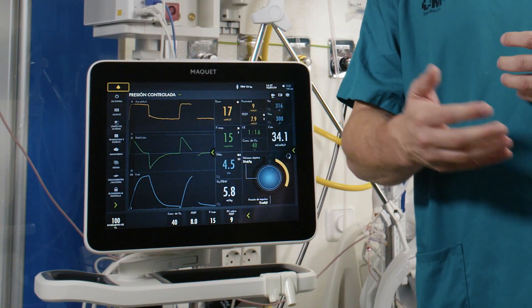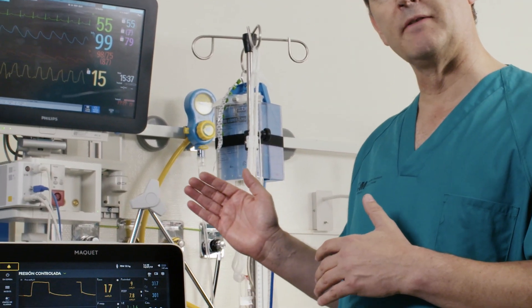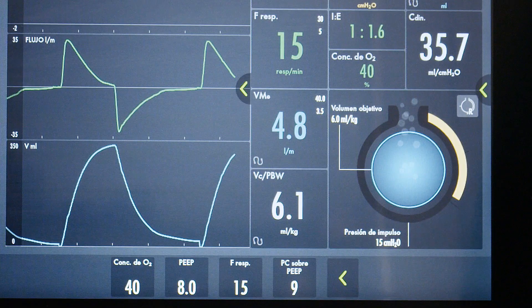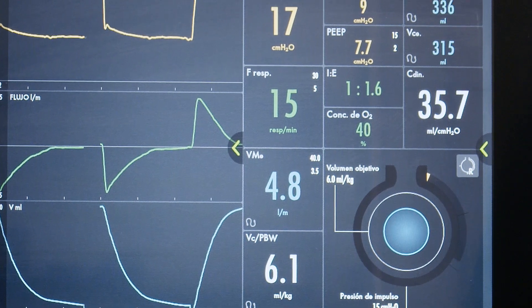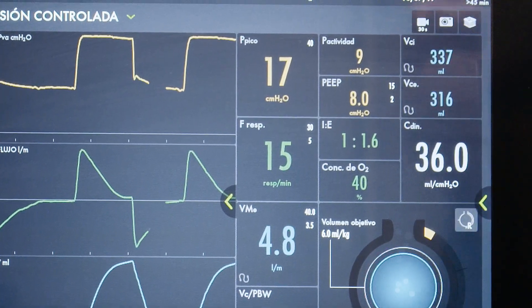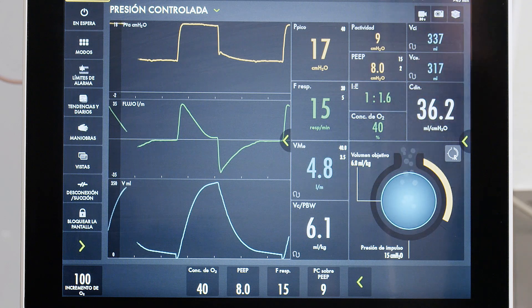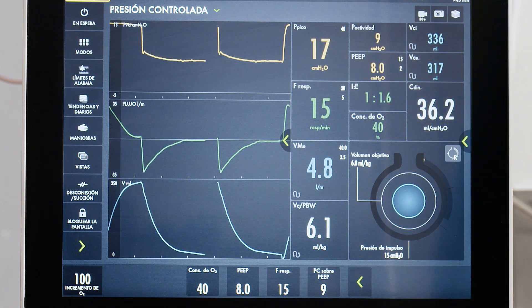Now the situation is 24 hours later. She has moderate respiratory failure due to an aspiration pneumonia. We are ventilating the patient with conventional lung-protective mechanical ventilation in a pressure control mode, with a PEEP level of 8 cmH2O. The driving pressure is 9 and the plateau pressure is 17, producing a tidal volume of 6 mL per kilogram predicted body weight.